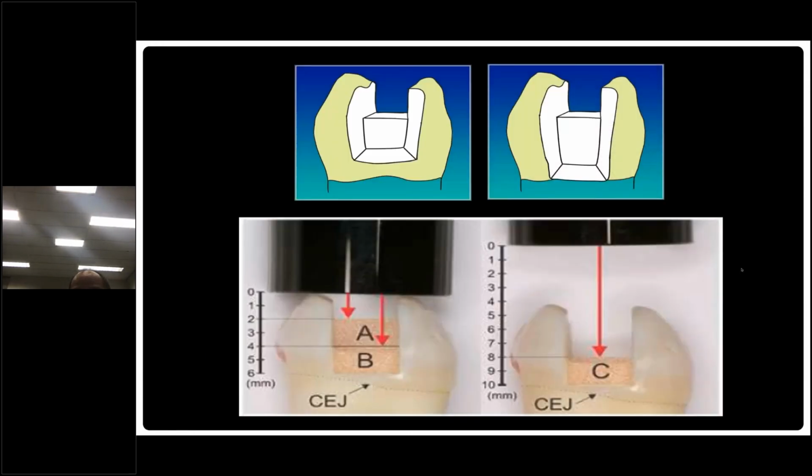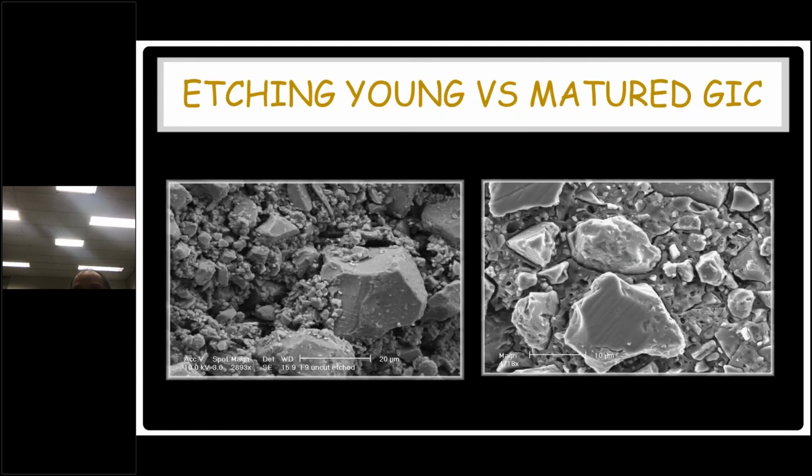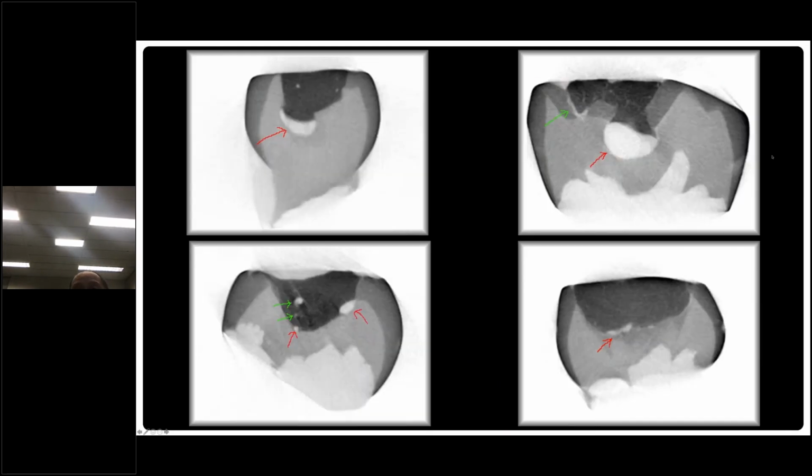And one last step I just want to share with you is to avoid having an air trap at the base of it. The only way you can do that is by using a encapsulated version of the material. If you don't do that, then this air void will definitely form under the lesion.